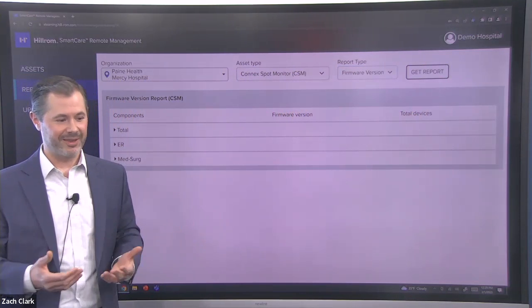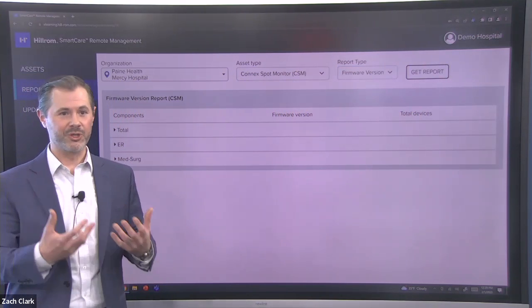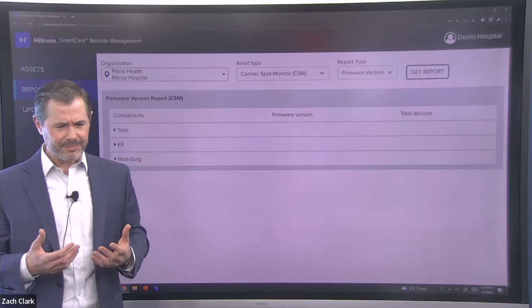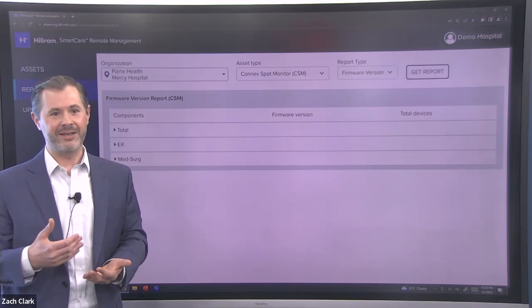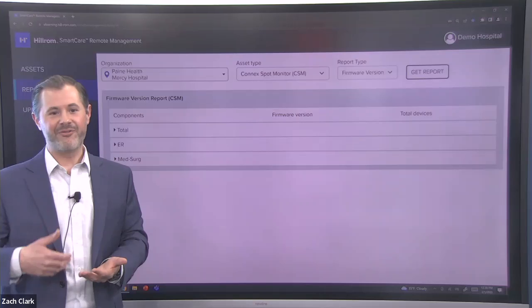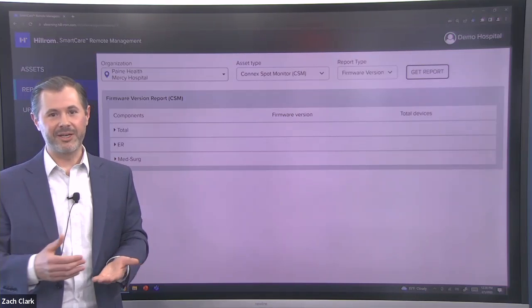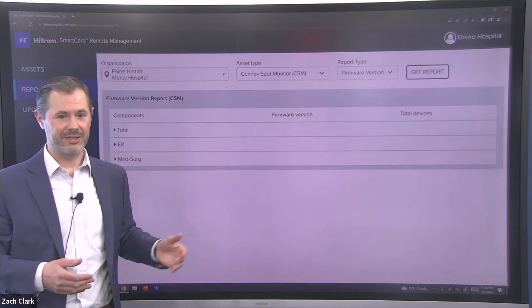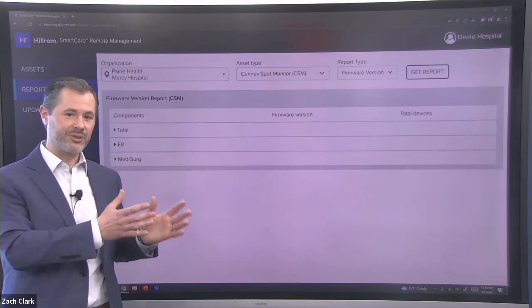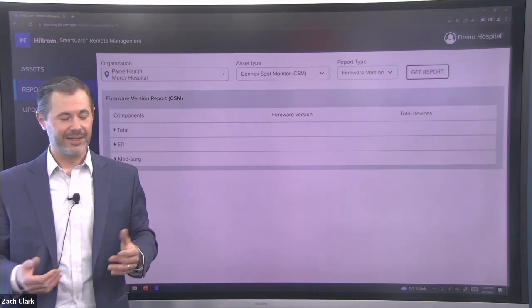And that's also something that may be recorded in an asset management report when you first receive the monitors from us. But over time, if you're performing preventive maintenance and you do a firmware update, that information is tough to record. And over the past several years, we have released subsequent versions of firmware for all of these devices. So at any point in time, the version of software that we're shipping versus the version of software we have today could be different.